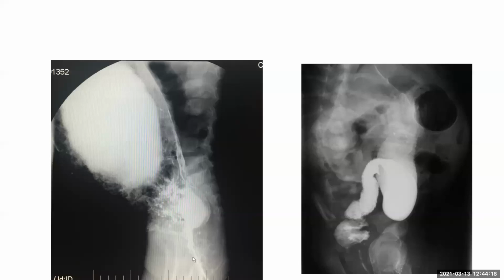In this case, like in the stage 4 cases that we saw, this is so obvious that I sometimes feel we are overburdening the patient and the departments for such cases. What more information will we get from an MIBG scan when we already see this bone metastases and all?